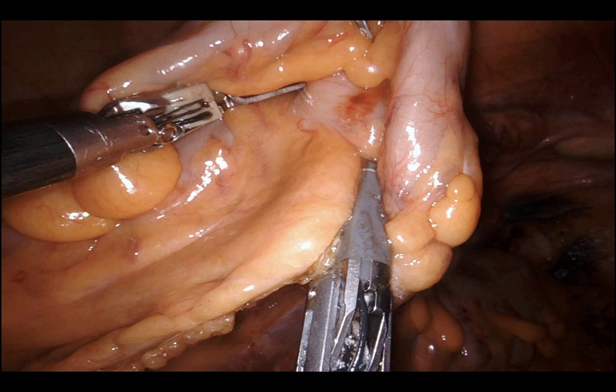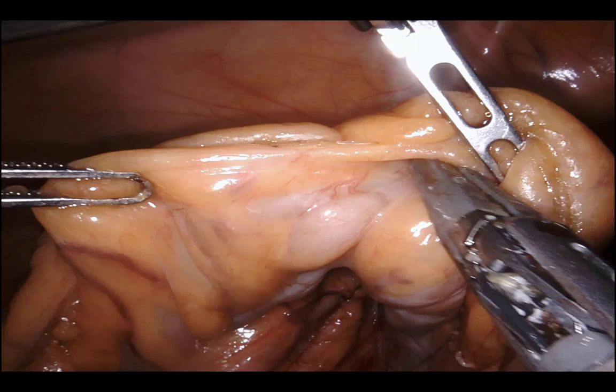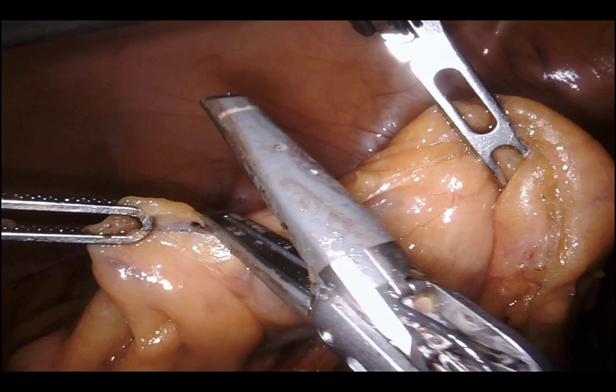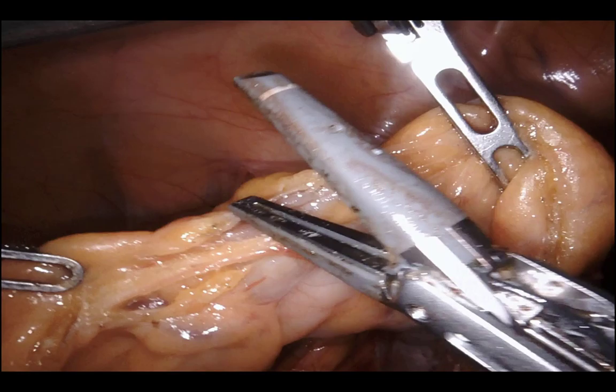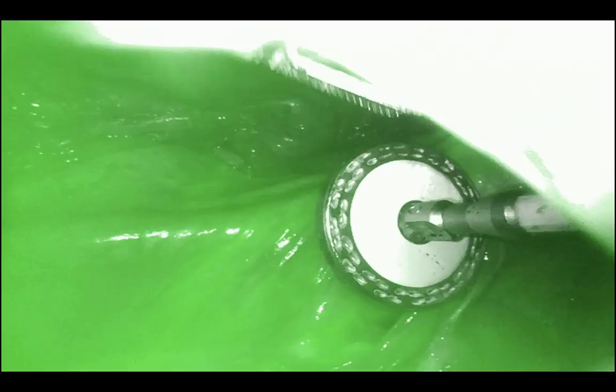Skinning down the final mesenteric attachments with the vessel sealer. The moment I take that last attachment, I call for 2.5cc of ICG with a 10cc flush. Checking for length — looking pretty good. ICG goes in and everything is illuminating nicely.